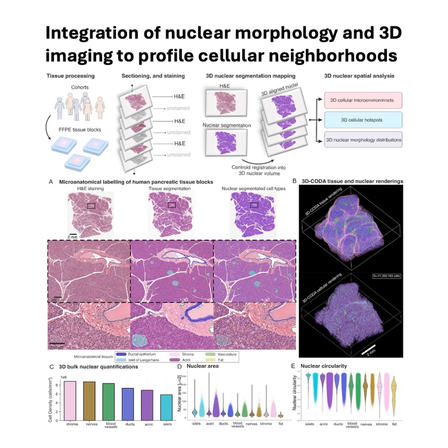So this level of detail, this nuanced heterogeneity, gives you a much more precise fingerprint for what healthy tissue looks like, right? Which could be huge for spotting early disease. Precisely. It sets a much richer baseline. Okay, finding number 2. This one sounds really important for understanding disease. Mapping immune cells, finding those immune hotspots.